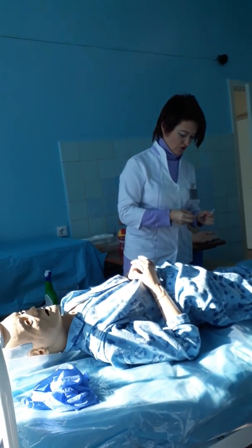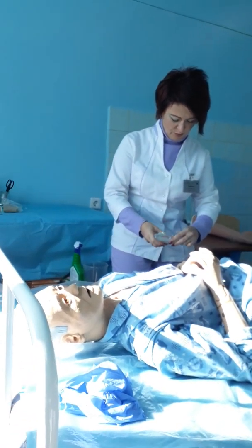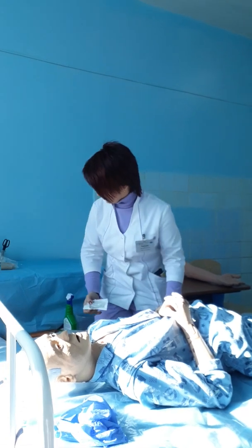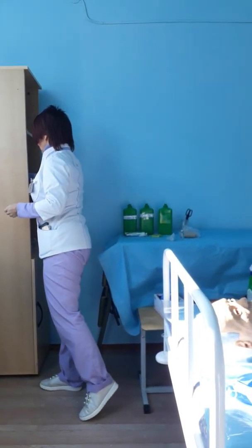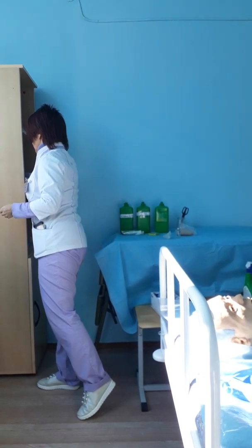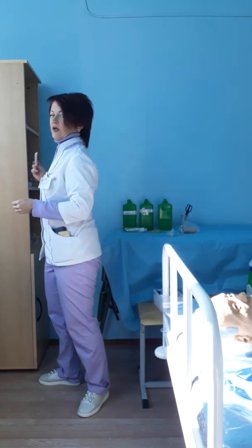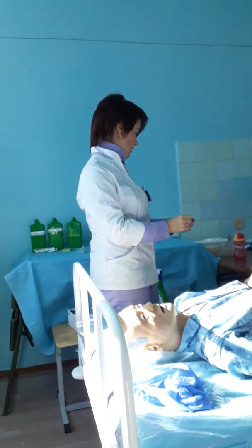In an emergency situation, you can use it. You prepare the syringe, and if you have to aspirate your solution from an ampoule or vial, you prepare an additional needle, and this additional needle must always be green, only one size.